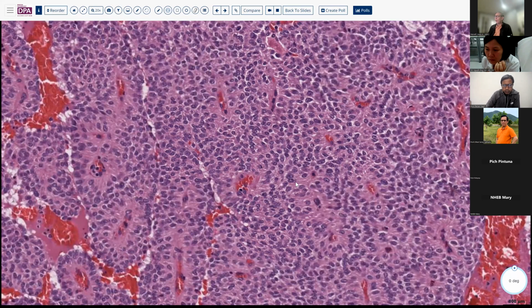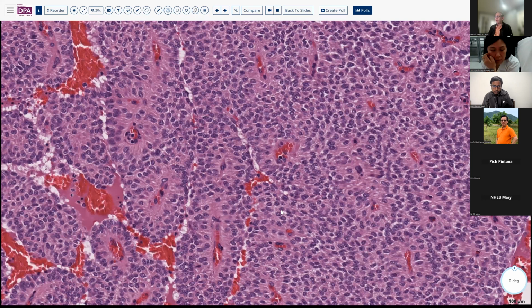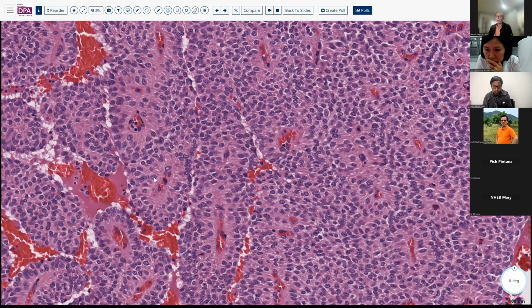They're round oval. Now, they do tend to have nuclear grooves, which is a nice marker and somewhat helpful because most neuroendocrine tumors do not have good nuclear grooves. Now, I can't show you them quite as well as I could if I had higher magnification because we only scan this at 20x. But here you can see a groove in that nucleus, and there are a few others. Here's one here, and a few others if you were to look around here.